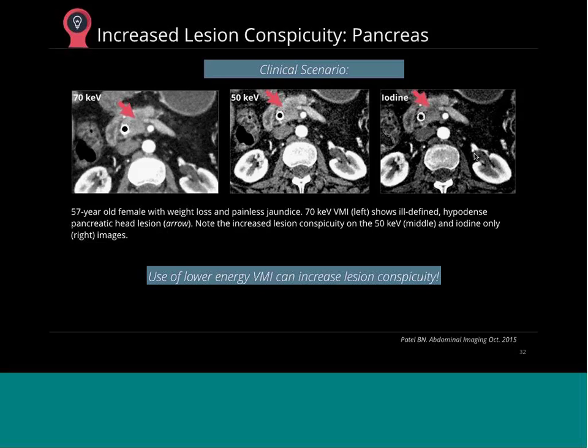These are the iodine-only images. With GE, you get iodine-only images. With Siemens, straight off the server, you'll get iodine overlays. What this does is the algorithm looks at every single voxel and says, let me see how this little whatever material is behaving. If it behaves like iodine, I'm going to make it bright on these iodine images. If it doesn't behave like iodine, let's say it behaves like water, I'm going to make it dark. It's a very crude way of explaining it, but essentially what you should know is if it contains iodine, the algorithm makes it bright.